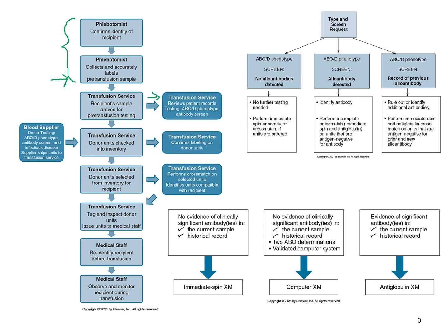that there's nothing in your facility, but you can't really rule out the possibility that the patient was transfused somewhere else. So because you do not have that history, you're just going to have to work off of what's before you. Sometimes, depending on what you run into, you can get more information from the nursing staff and have them actually ask the patient if you need more details.